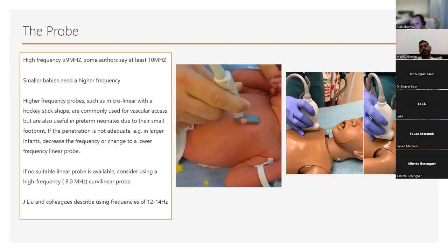Now, if you use a phased array probe, you can. The challenge with the phased array probe is it often makes the pleura quite small because it's got this kind of configuration. So really, you just have to be aware of the fallacies that you might be interpreting the pleura very superficially, and it might be tricky when you're trying to interpret sliding and subpleural consolidations, which are very superficial. Again, altering your frequency and altering the width. In some machines, you can alter the width that you get with the phased array probe to make it as wide as possible.